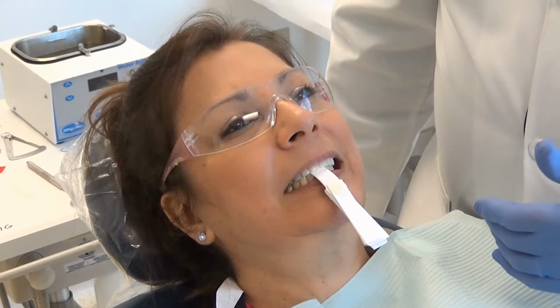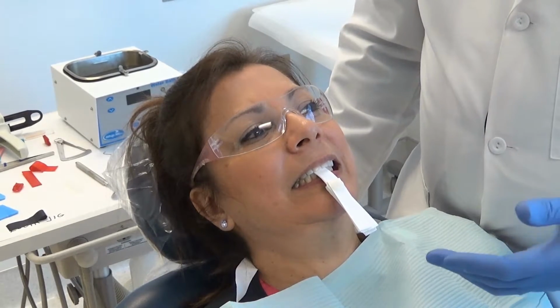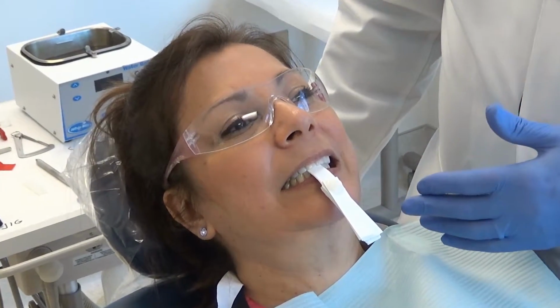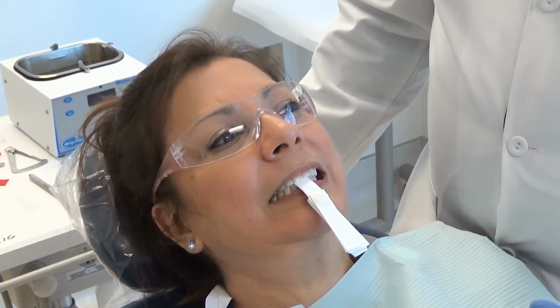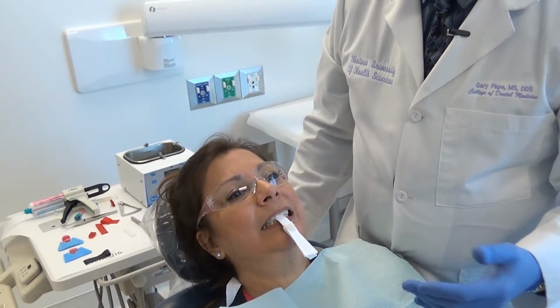So later when we mount the models and we mount them using our centric relation record, what should we find when we check the models? We should find that the first point of contact on the models is the exact same tooth that we found in the mouth, and it should be that second molar. If you find that, that's one of the ways to tell whether or not you've mounted your models correctly in centric relation, and your centric relation record was accurate.